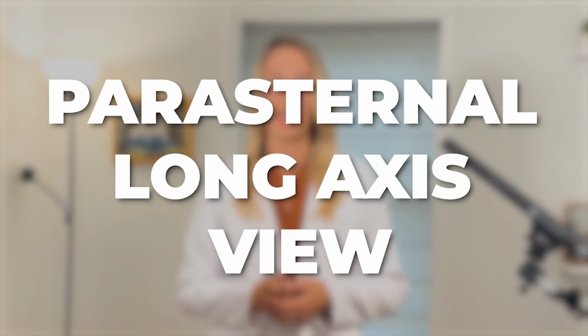Now, we're going to talk a little bit about what we look at when we're looking at an echocardiogram. It's like looking at a house from different angles. From the front, you're going to see the front door. From the side or the back, you might see a side door or a backyard. And so we look at the heart in a number of different views. Today we're really just going to talk about the different views that we look for when we're talking about echocardiogram. So the first view we typically see is called the parasternal long axis view.